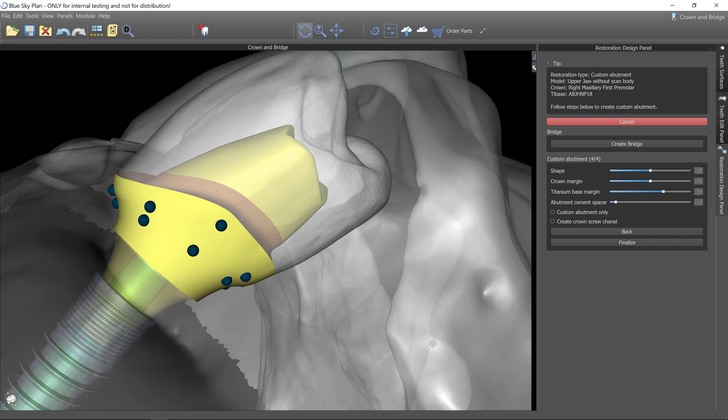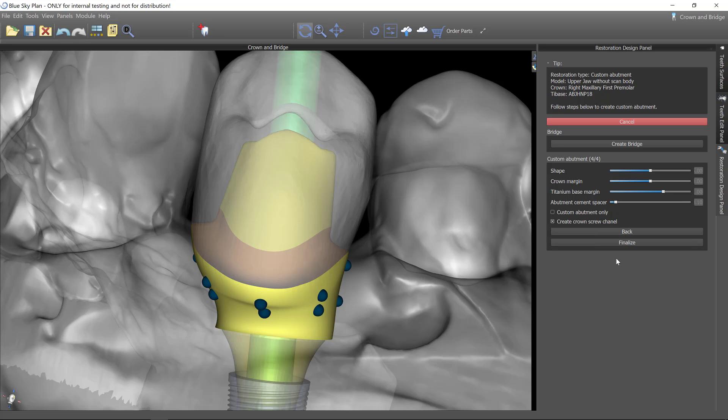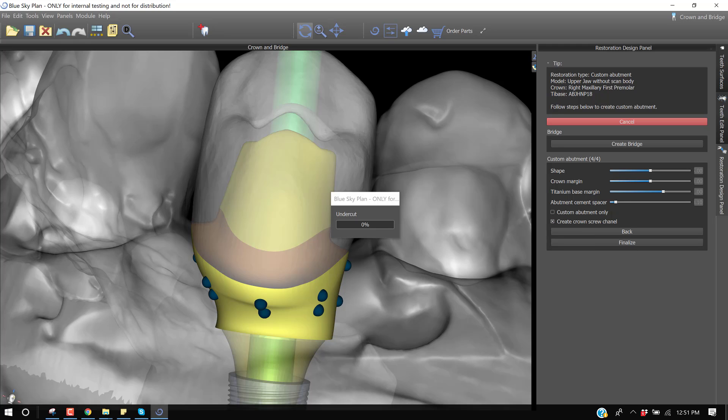Let's go with this as the custom abutment. So now I can finalize it. I could say that this is a custom abutment only, or I could say, let's create the crown as well with the screw channel. So I'm going to check that and then finalize.